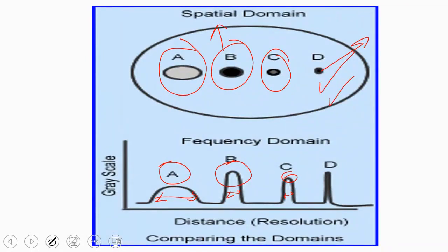Each object has a specific size, and the machine's ability to see very small objects reflects its resolution. You can determine how large an object is based on this. Of course, nuclear imaging is considered the worst imaging modality in terms of resolution. It is indeed the worst in this regard, right?